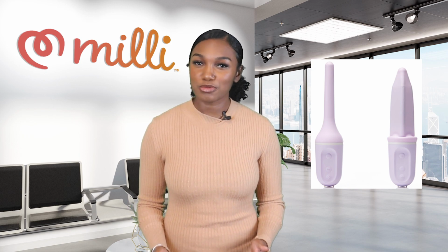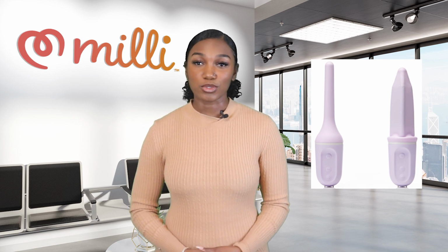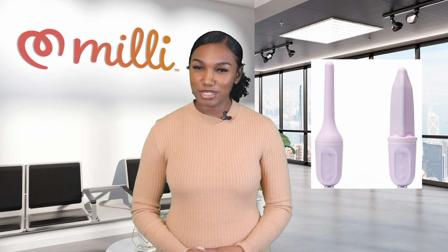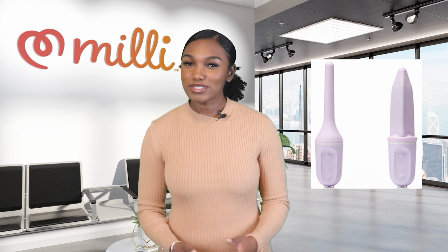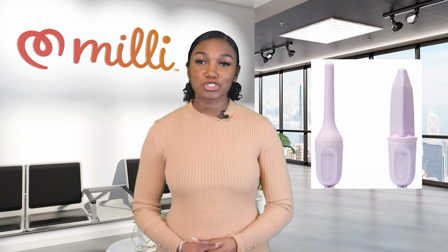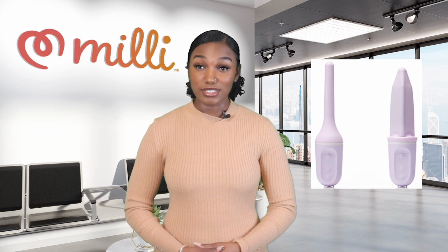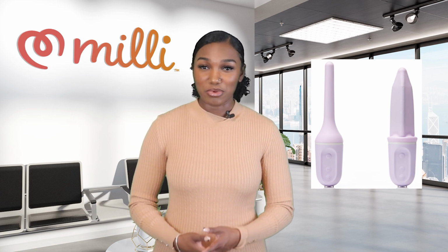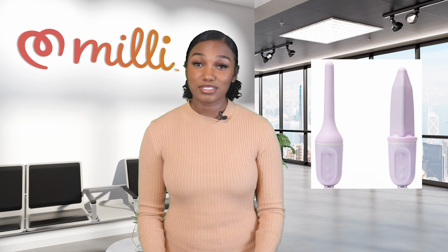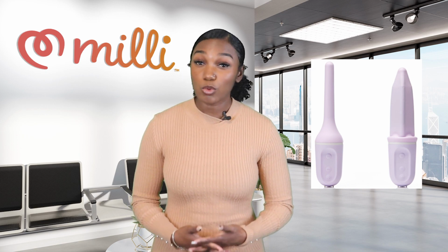How long you will use your Milli device will depend on your underlying condition. Some Milli users will achieve the ability to return to penetrative sexual activity and will not need to continue dilation therapy, but others may need to routinely use their Milli to help relieve their symptoms of vaginismus and associated pain with vaginal penetration. Please know that dilation therapy is a gradual process, so keep working towards your goal and be patient with your progress.